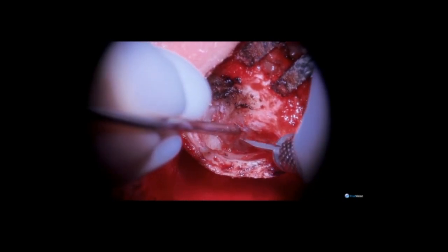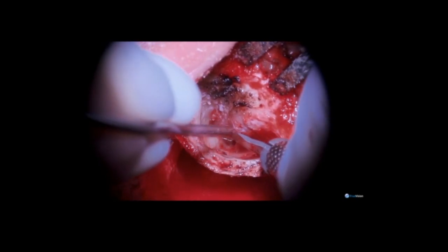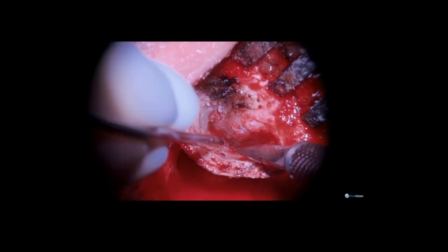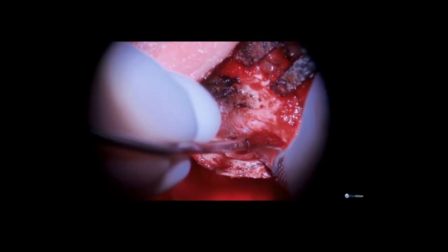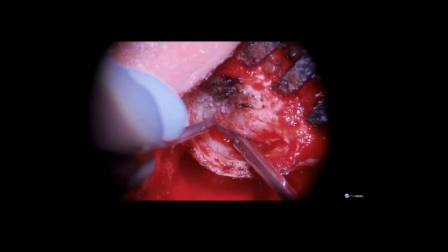At this point, I will incise and create a Koerner's flap using a combination of a sharp 6500 Beaver blade and a Bellucci style microscissor.